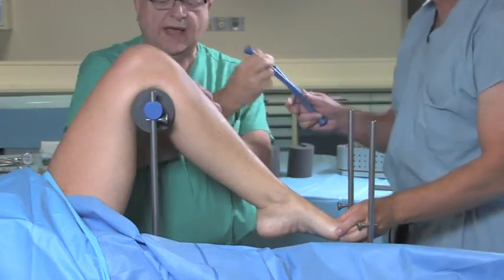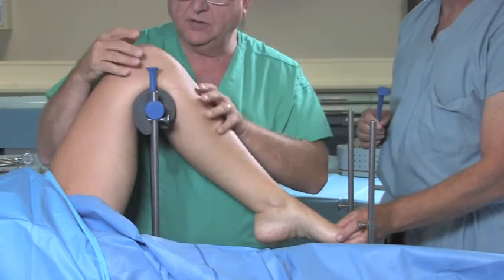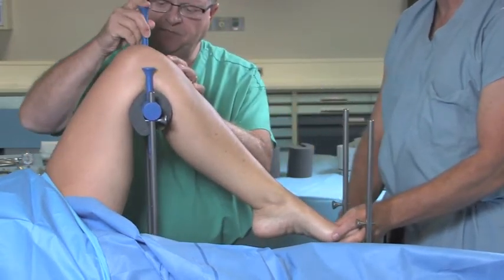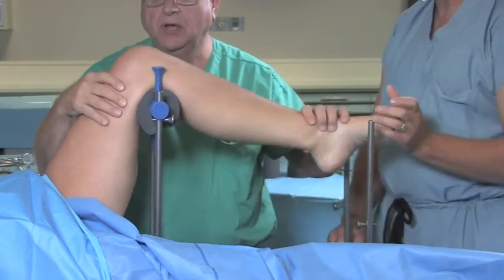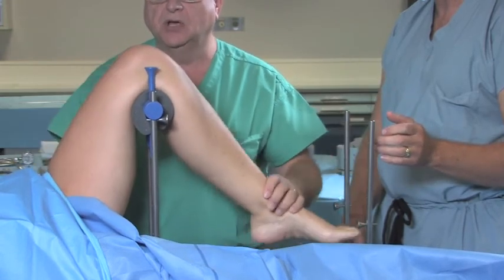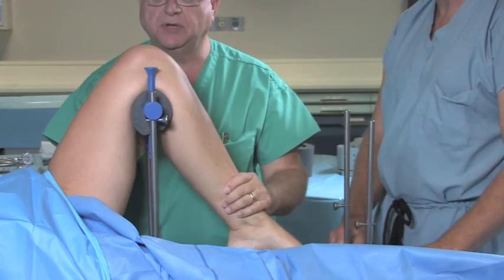Using the blue T's, anchor the knee with both of them. We can now perform various valgus stress movements about the knee axis for possible knee arthroplasty or arthroscopy.